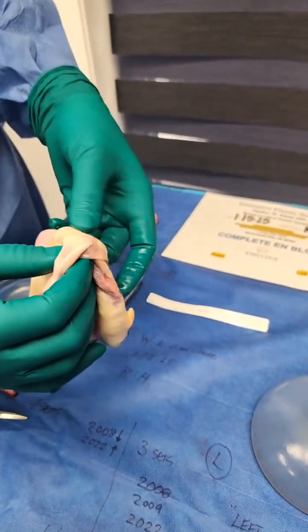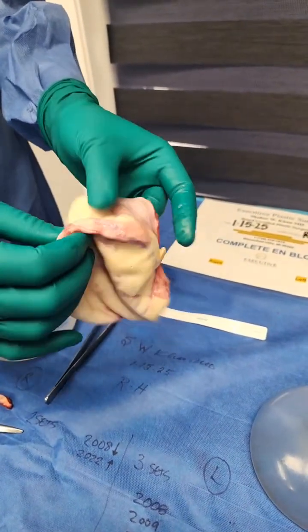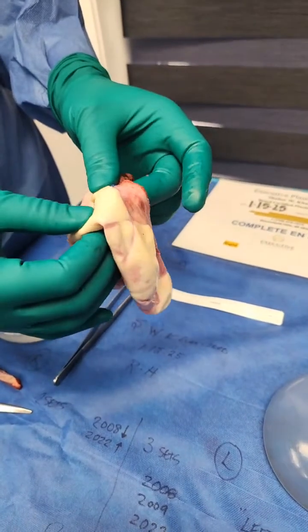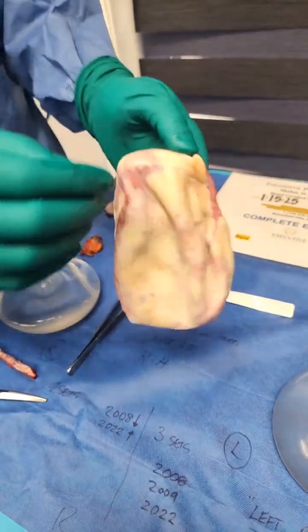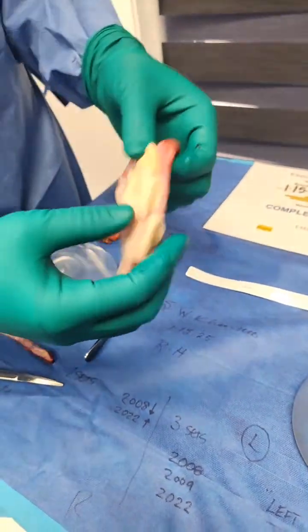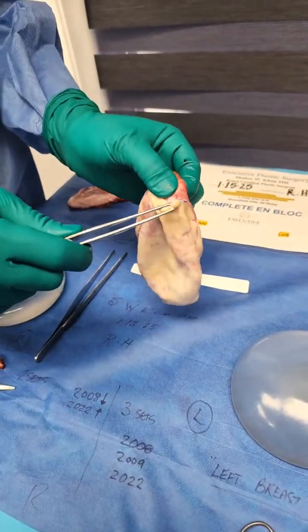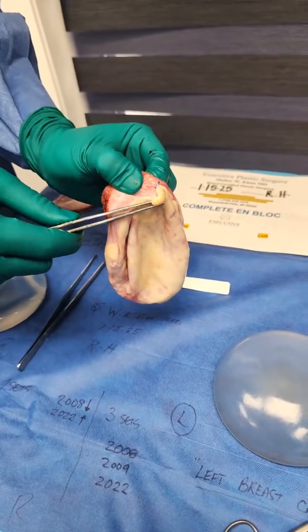Now this is a technique. What they do is they suture the whole alloderm around. It's well published, but you can see all this Prolene suture that was used and visible for me as I was dissecting. So it was important for me to remove all of this foreign material. You can see this is the alloderm. I'm going to go ahead and see if I can tease this off.